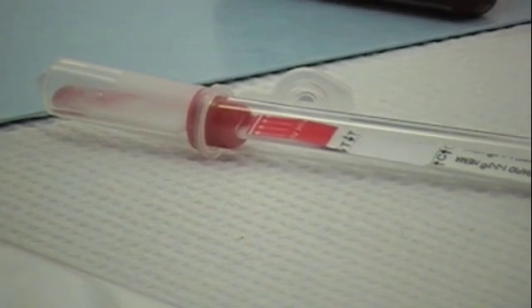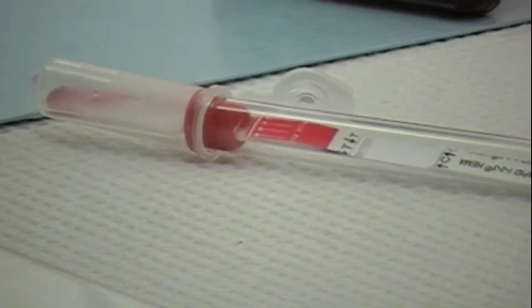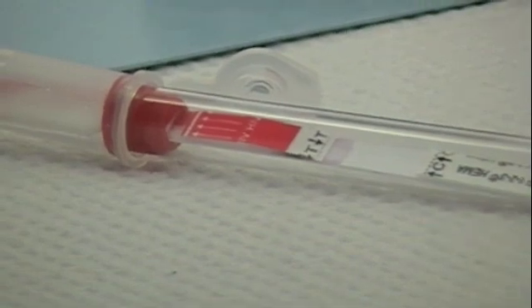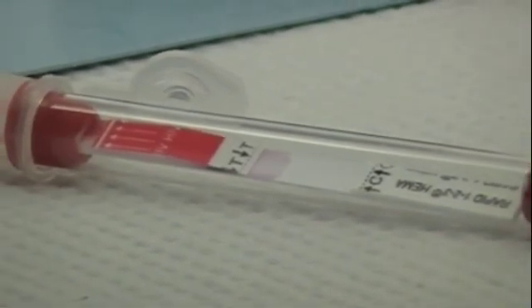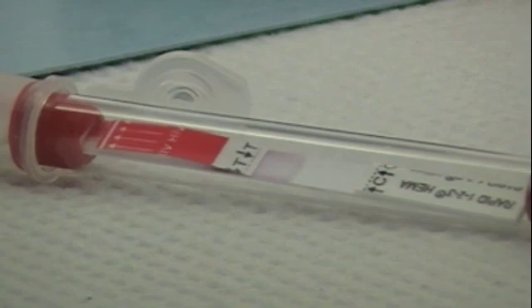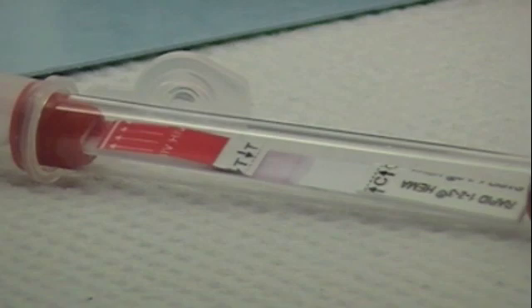We are waiting to see the migration of both the diluent and the sample onto the membrane. We are starting to see it flow up the membrane area, just passing by the T line area and flowing up towards the C or control line area. Please remember that we are using a positive sample for the HIV virus, so we will obtain a positive result at the end of the test.